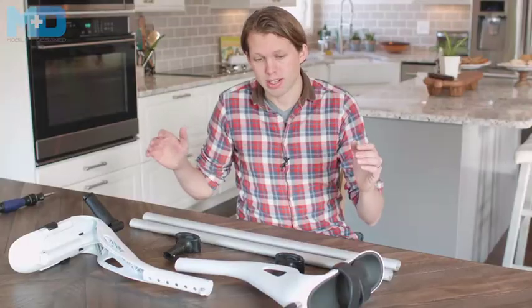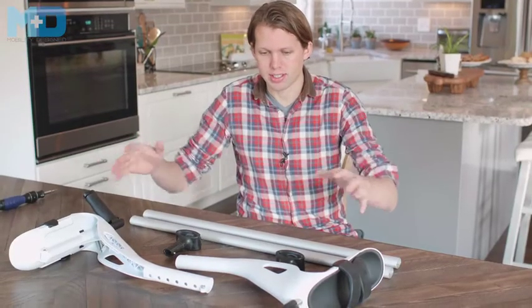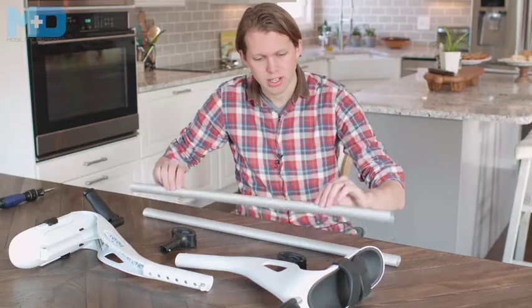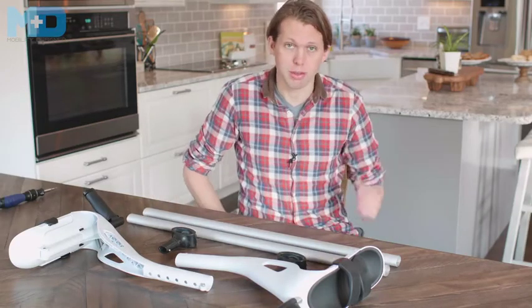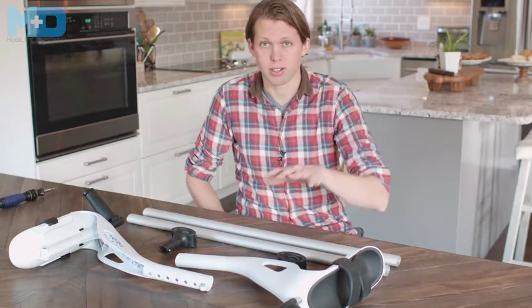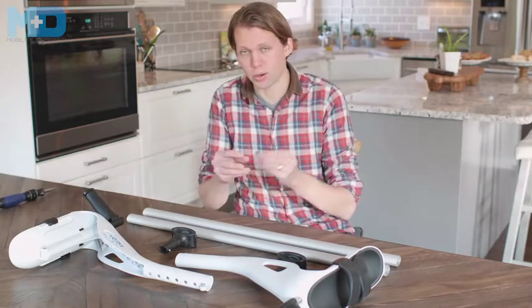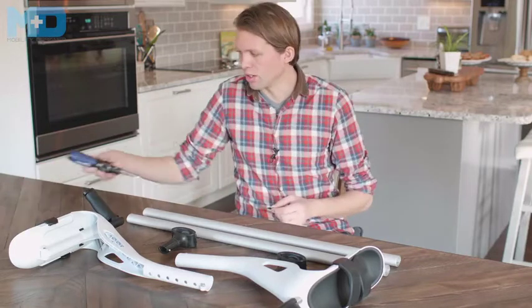When you open your MD crutch box, the first thing you're going to see is the crutch bodies on top with the feet, and then below, underneath the cardboard, the two leg tubes — or if you bought a single crutch, there'll be parts for just the single crutch. The only other thing you're going to need is either a coin like a nickel or a quarter, or a screwdriver if you desire.